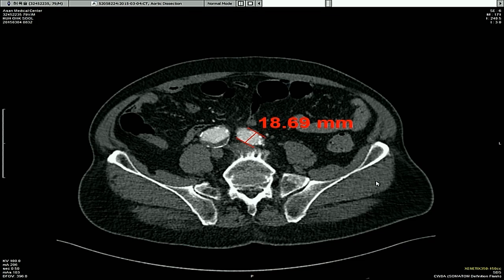Feel free to speak. I'm a vascular surgeon. This right common iliac artery aneurysm is around 26. It's less risk for rupture. So if this patient has a little problem in pelvic circulation, we can save this right side internal iliac artery with the bell-bottom technique from the Medtronic device. So that is another option.